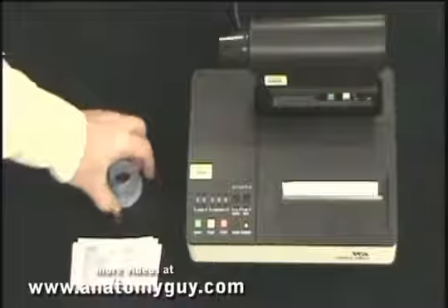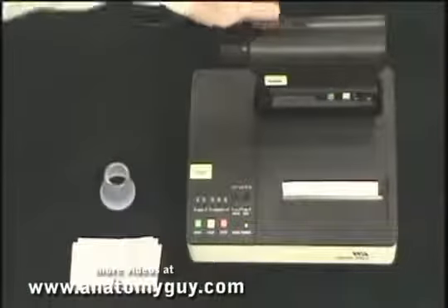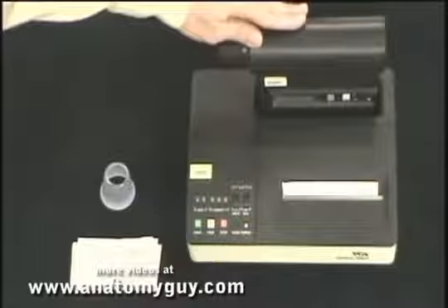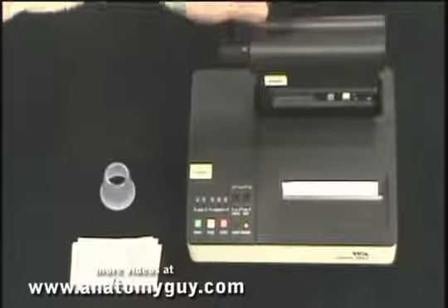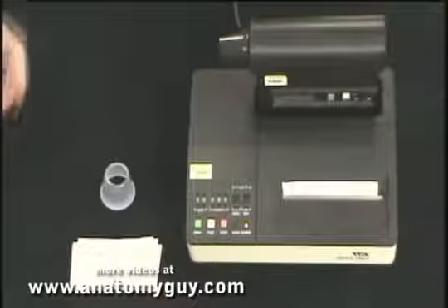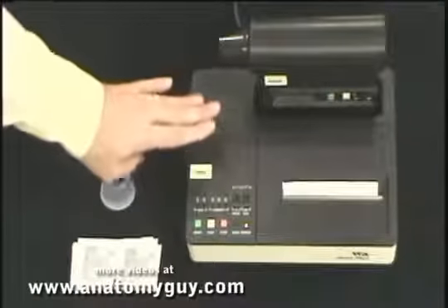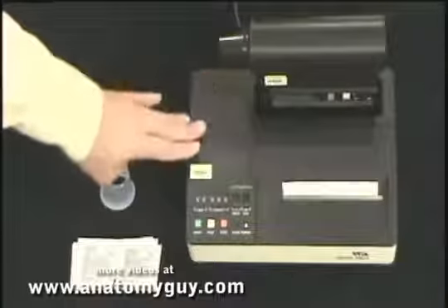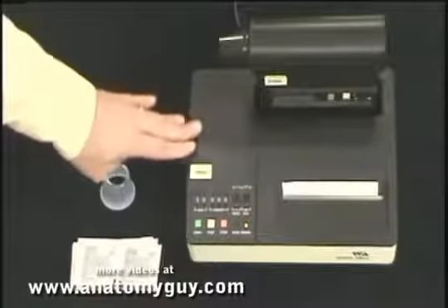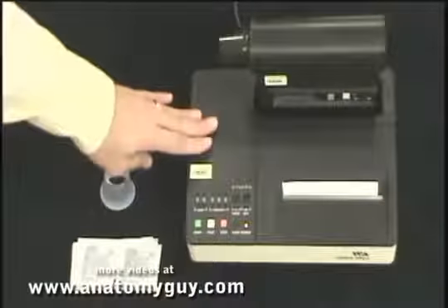This machine has important functions, a mouthpiece, which you want to make sure your machine is clean. Any of the digital machines require calibration, usually with a large plunger that will give you a measured amount of air so that you can calibrate the machine. The most important thing is making sure that you know your machine and how it works. Many are attached to computers now, and some have extra functions. This is a very basic model.